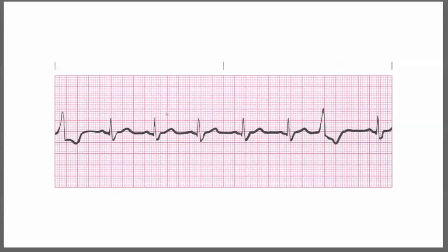This is the last installment in terms of premature contractions and determining how to recognize one from another. You're looking for the difference between a PAC, a PJC, and finally a PVC. We've looked at the premature atrial contractions, we've looked at the premature junctional contractions, and now we're going to recognize the PVC, or the premature ventricular contraction.